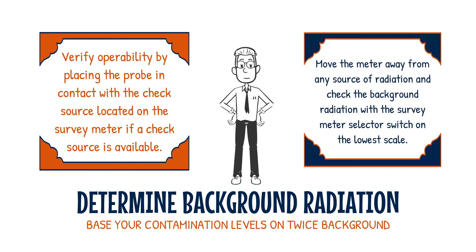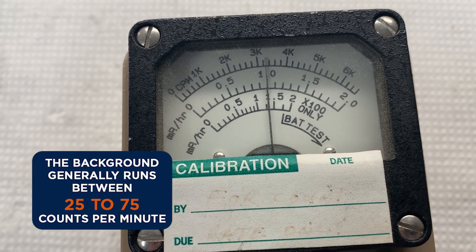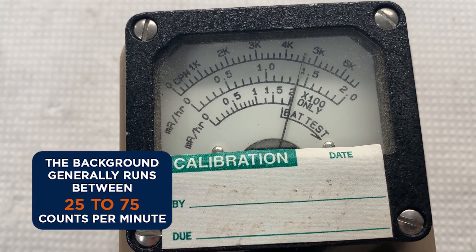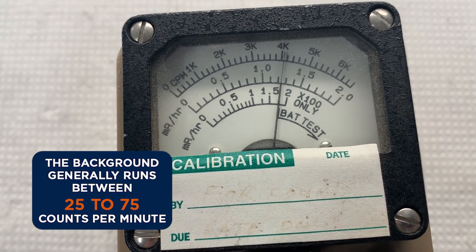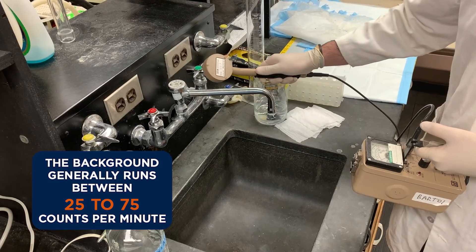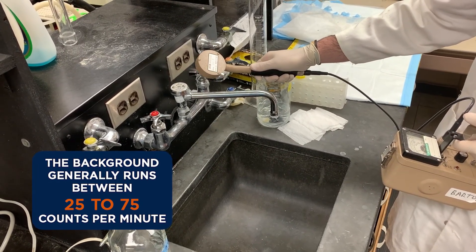Move the meter away from any source of radiation and check the background radiation with the survey meter selector switch on the lowest scale. The needle on the meter will fluctuate, so take an average. The background generally runs between 25 to 75 counts per minute, or CPM. You will need to determine the background so you can base your contamination levels on twice background.